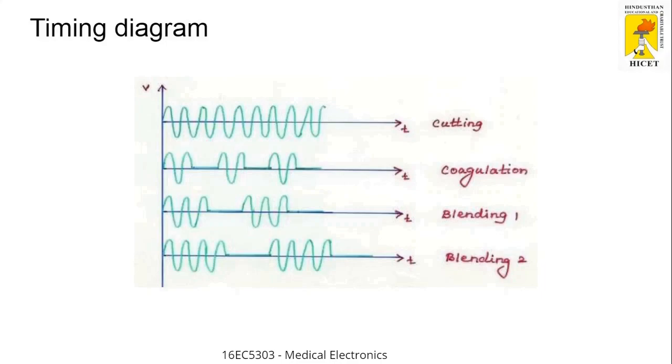Okay, it also depends upon the place in which you are going to combine the tissues. It may be the skin available over an elbow, or it can be the skin available across the toes or something like that. Okay, so that is what is given here.